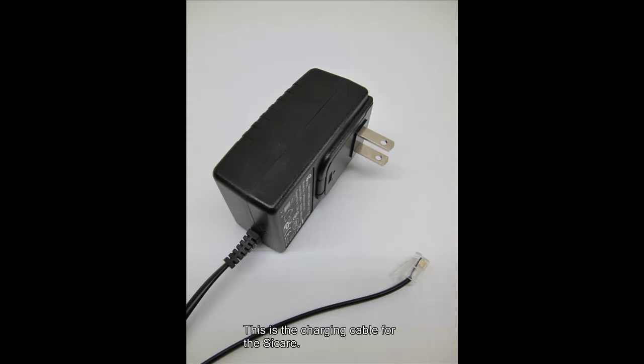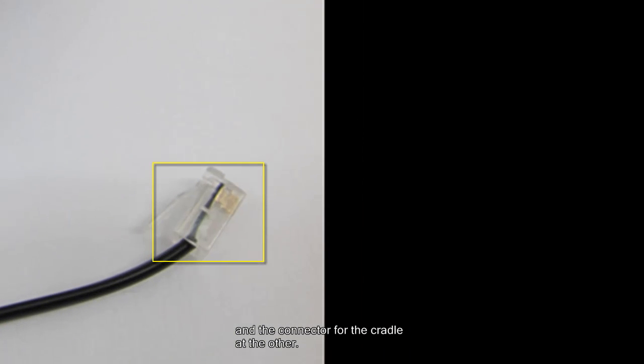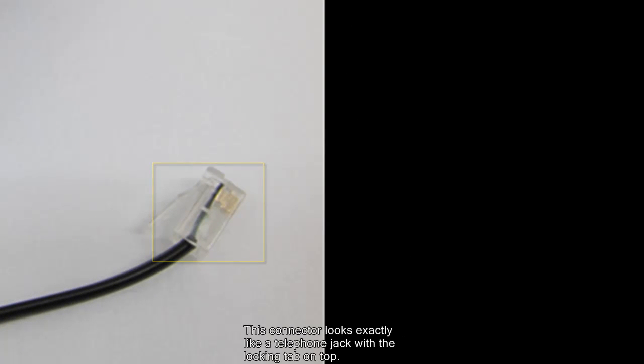This is the charging cable for the Sicare. It has a standard 2-prong plug at one end and the connector for the cradle at the other. This connector looks exactly like a telephone jack with the locking tab on top.